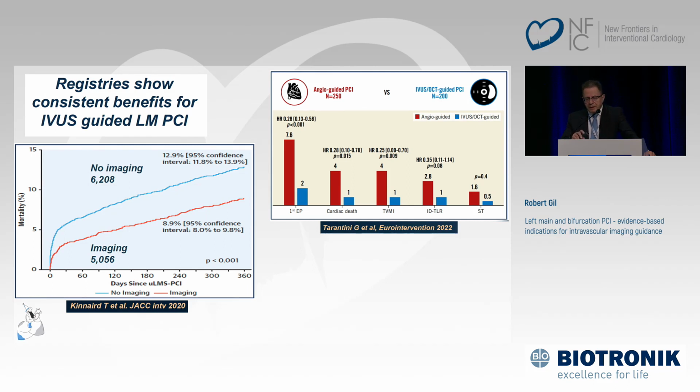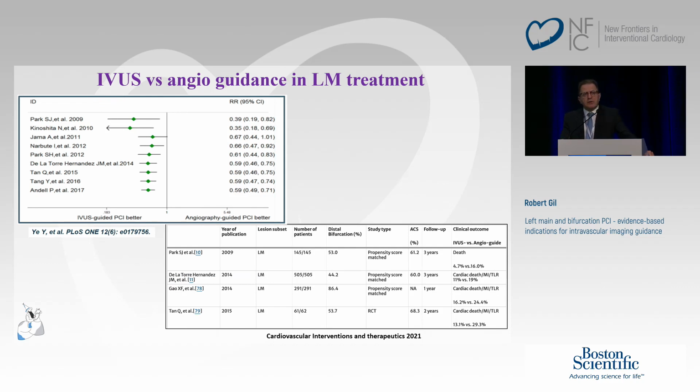The Italian ROLEX was already presented. There is no doubt that a properly performed IVUS assessment makes a difference. And of course, there are a lot of trials showing that this benefit and superiority of IVUS guidance exists. We should take into consideration these facts.